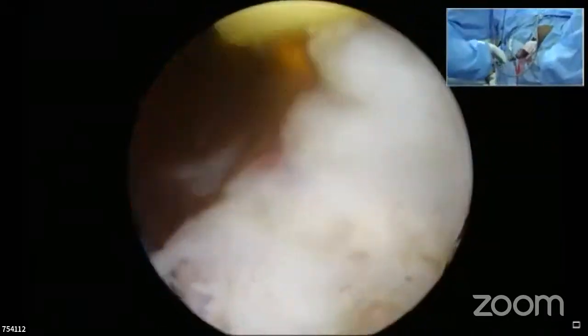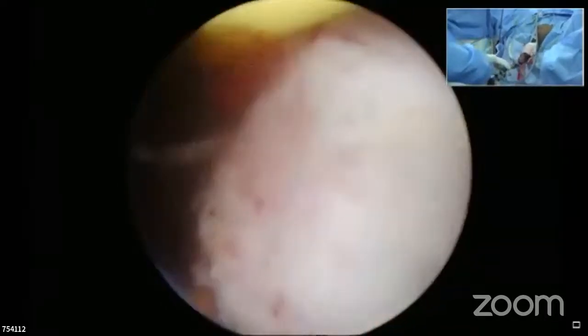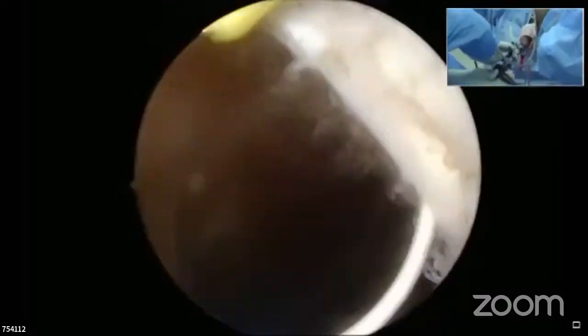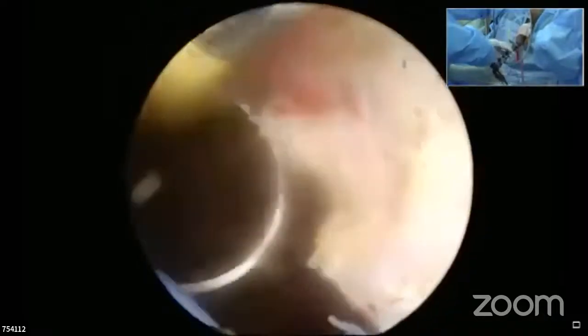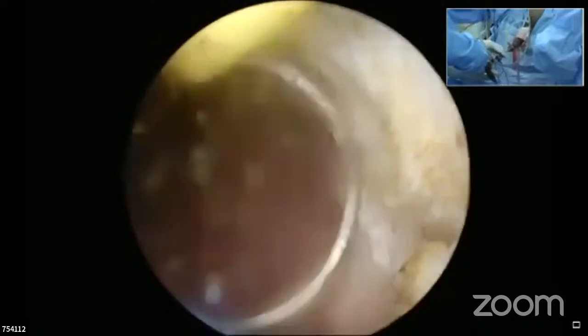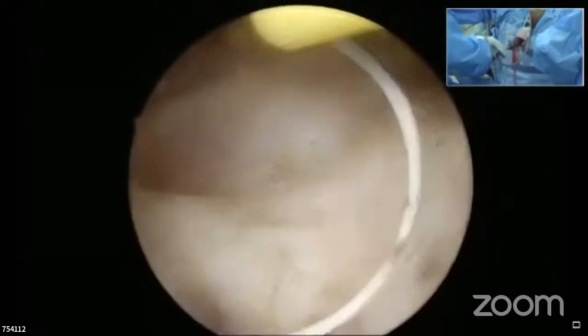Otis versus dilatation with bougies, using 26 French, is okay. If Otis is not available, dilatation with the bougies. I also do a routine Otis urethrotomy. And if I'm not able to put in my resectoscope, I will put a catheter, come out, wait 4 or 5 days, then go back and do it.